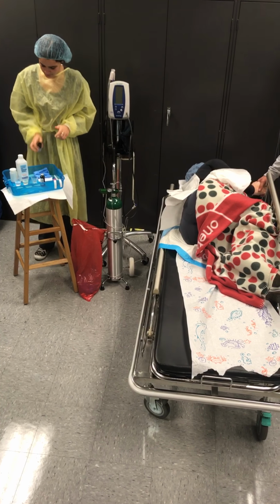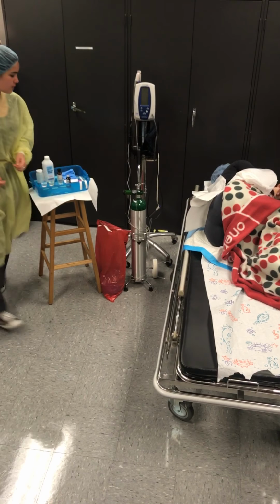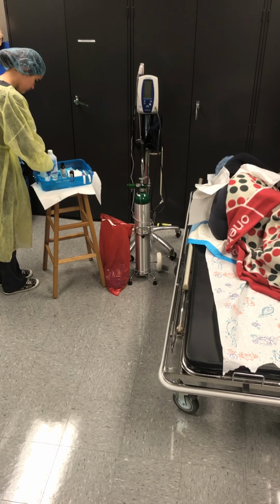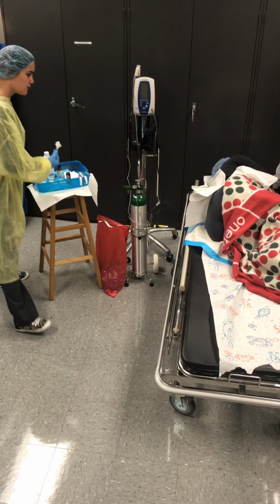Don sterile gloves. Just breathe. Okay. Prep the puncture site with antiseptic soap solution beginning at the puncture location and prepping in a circular manner. Asking the patient to breathe. Take deep breaths for me. It's going to be a little bit cold, okay?